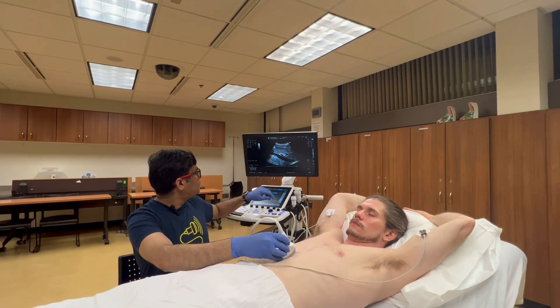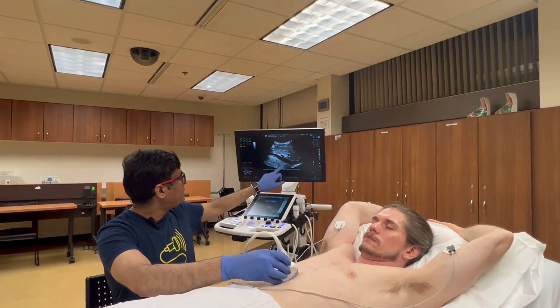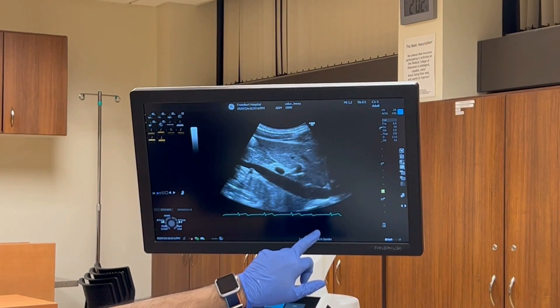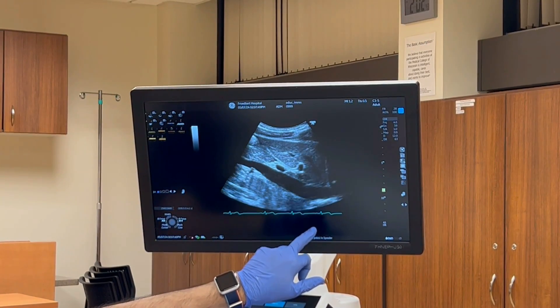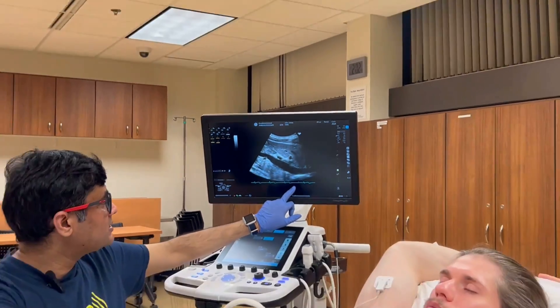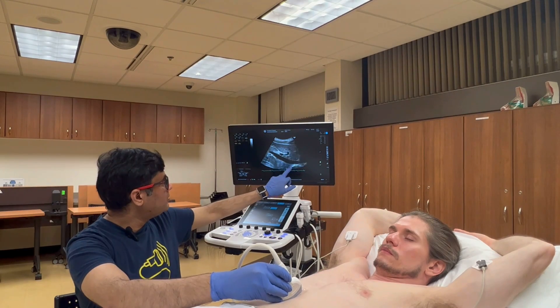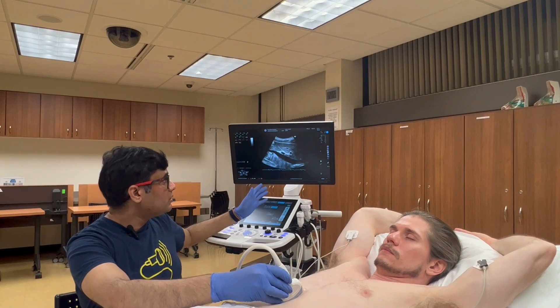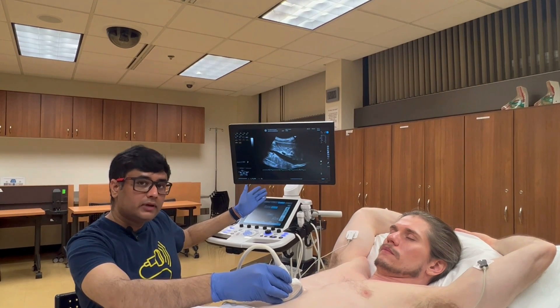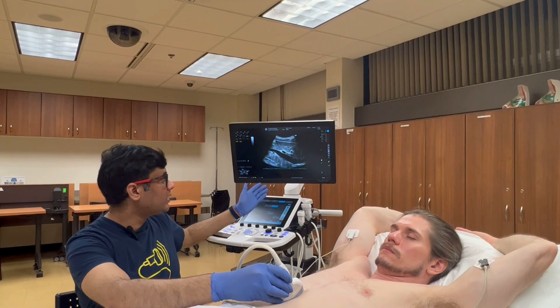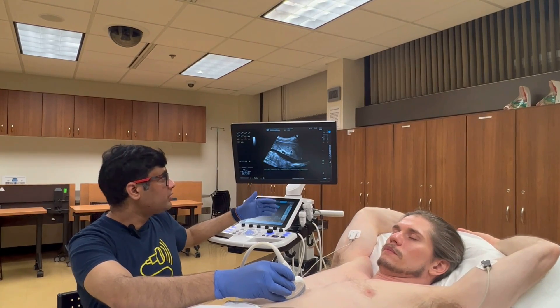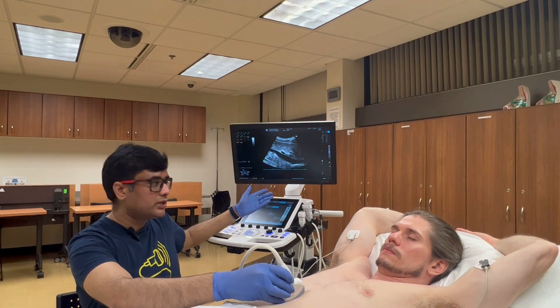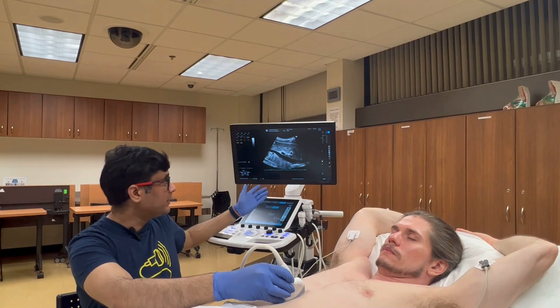I find the IVC right away. Here we have the liver and the IVC. I'm going to optimize it by fanning the transducer as well as gently rotating it to make sure I'm getting the maximal diameter of the IVC. You can measure the diameter of the inferior vena cava just below the hepatic vein-IVC junction, or you can just eyeball and see if it's more than two centimeters or less than two centimeters, if it appears plethoric or not.